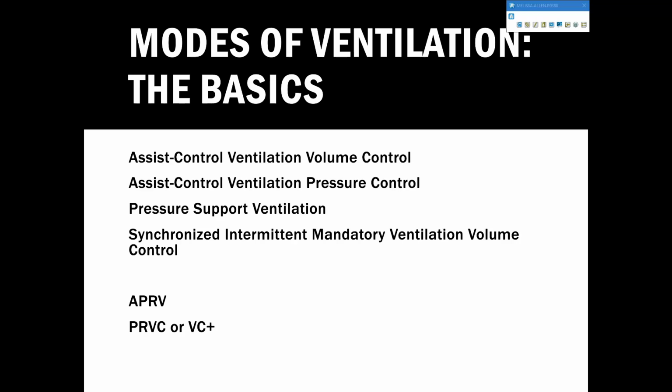With that descending flow ramp, we're giving a lot of flow at the beginning, and then it's tapering off. In pressure control, no joke, 110% is that true descending flow ramp.